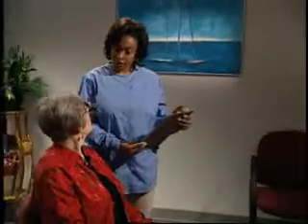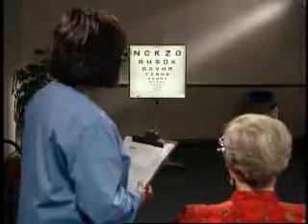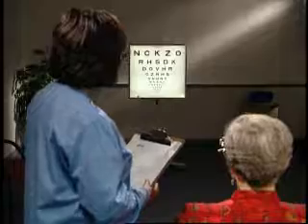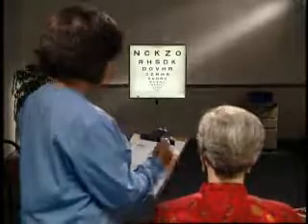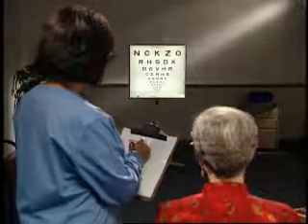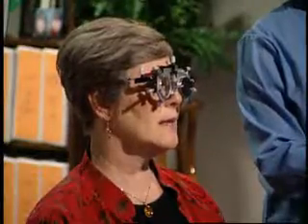Okay, Ms. Burt, I'm going to check your visual acuity now. I'd like you to look straight ahead at the visual acuity chart. Focus on the top left-hand corner of the chart. Read the letters from left to right. Please read the letters slowly, approximately 1 letter per second. This chart contains only letters, no numbers. Please read down as far as you can, and if you are uncertain of a letter, it's okay to guess. Please sit up straight and don't lean forward or backwards. You may begin. N, C, K, Z, O, R, H, S, D.